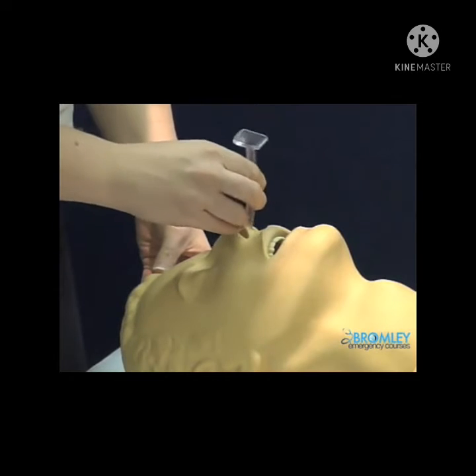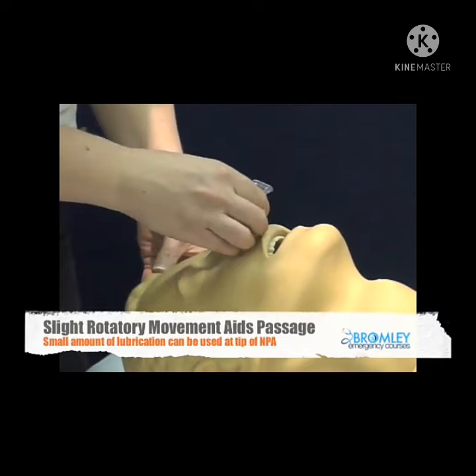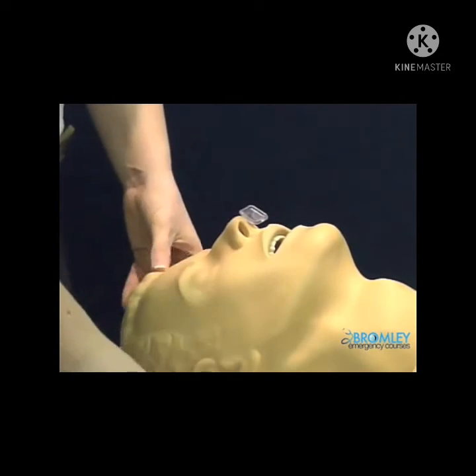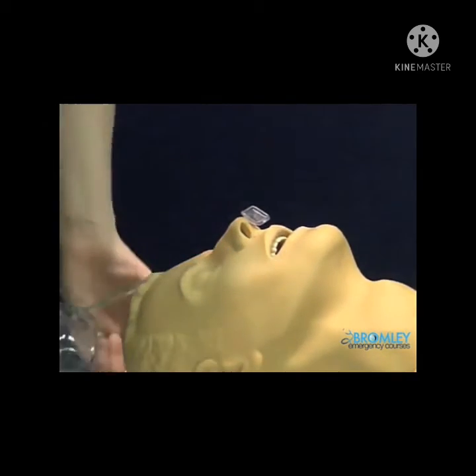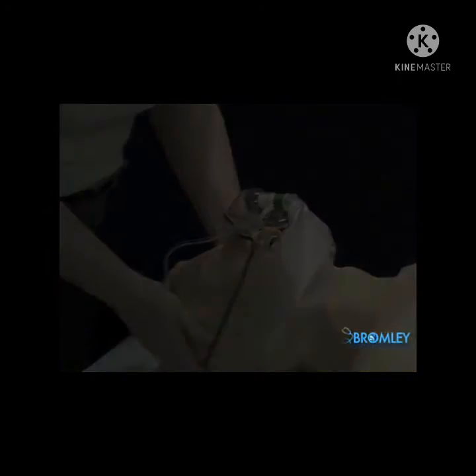And you insert it going directly back, not upwards, and push it down into the nostril. And again, apply the oxygen. This generally is better tolerated than the Goodell airway.